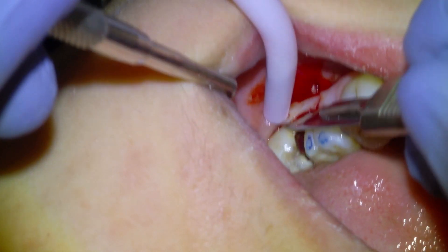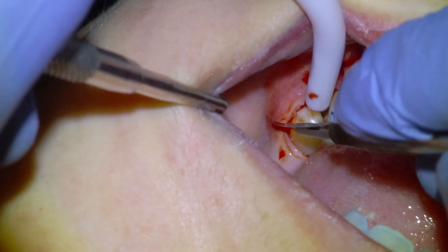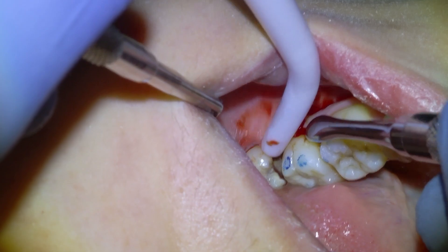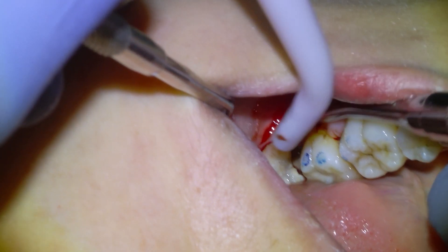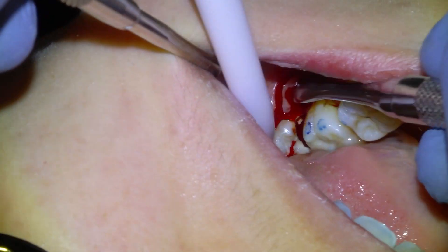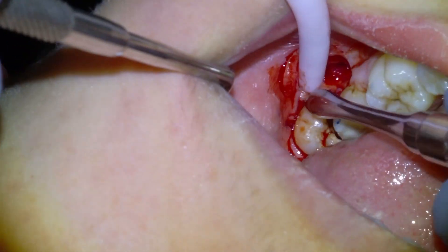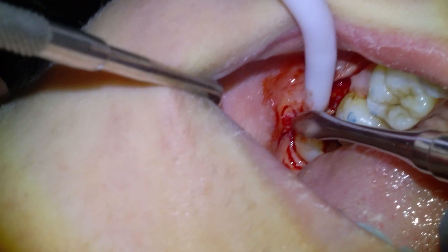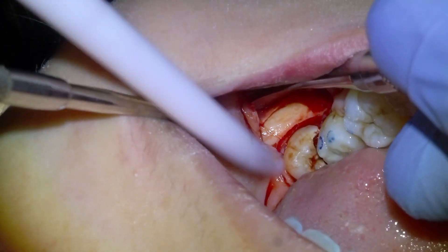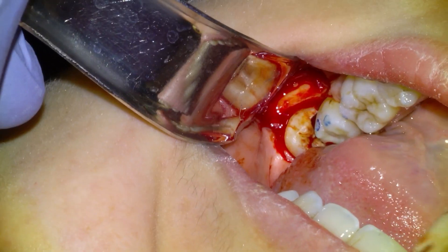We're going to begin the wisdom tooth extraction by laying a full thickness buccal flap, make a small releasing incision into the distal buccal of the wisdom tooth, and begin reflecting our flap with a Moult periosteal until we're on the bone. Once we're on the bone, we'll swap out the Moult for a Minnesota retractor and begin troughing our buccal bone.